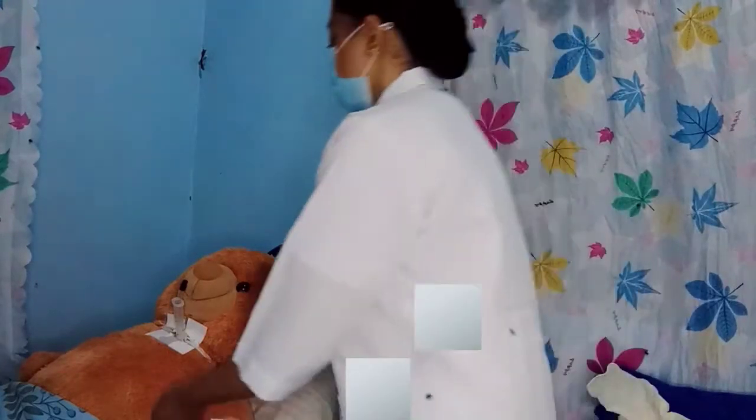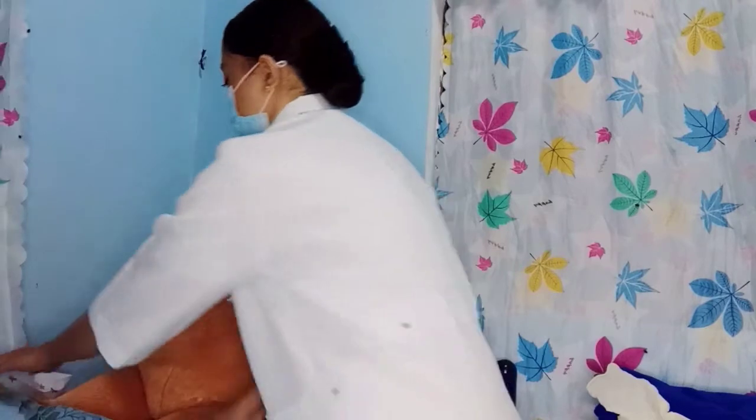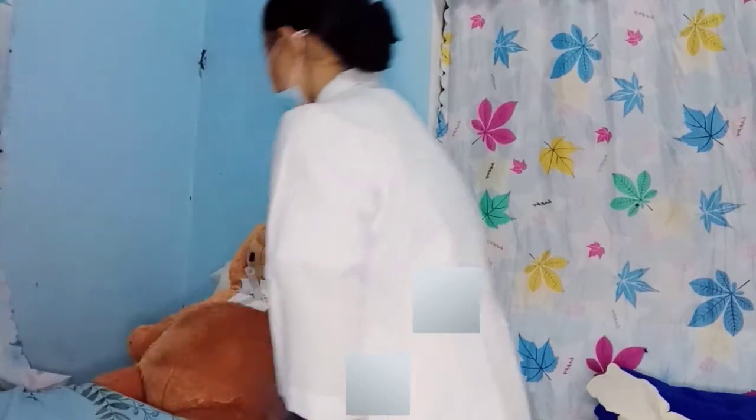Next, adjust the bed to a comfortable working position — usually elbow height of the caregiver — and lower the side rails closest to you. If the patient is conscious, place him or her in a semi-Fowler's position. If the patient is unconscious, place him or her in a lateral position facing you. Move the over-bed table close to your work area and raise it to waist height.